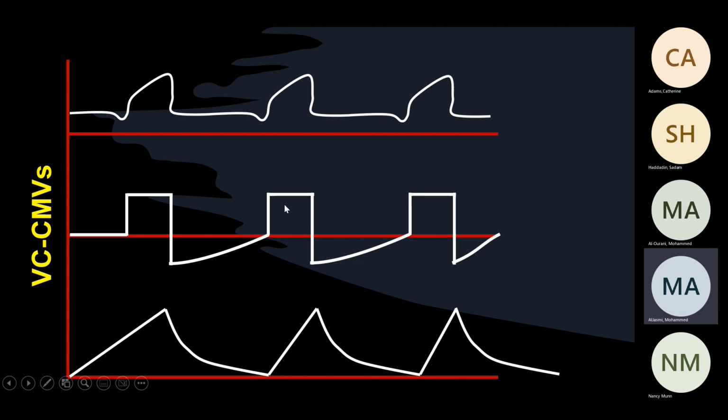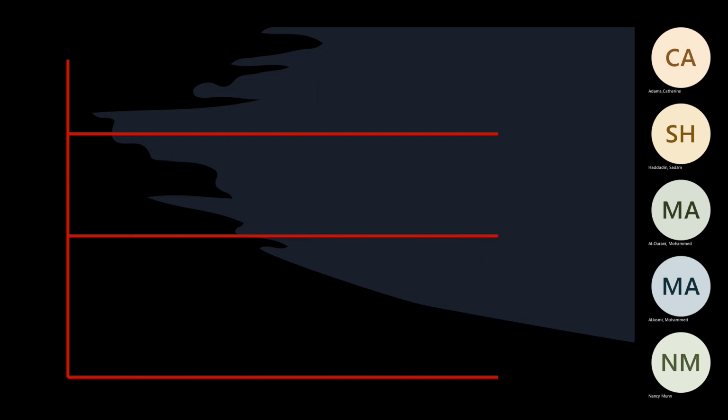Or if instead of square, you see a notch in here, you know that the patient is able to do something while they should not be able to. You cannot make any changes in CMV. If it starts changing, it's not CMV. It's impossible to be CMV. It's IMV, which is most of what we see here. All right.